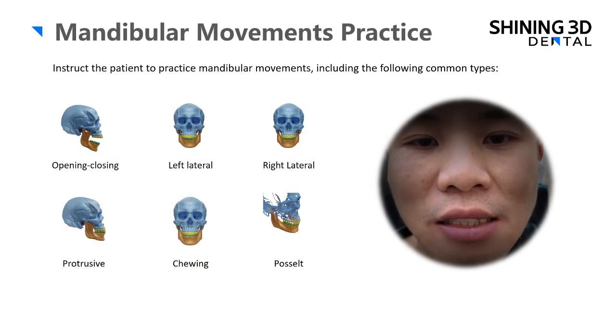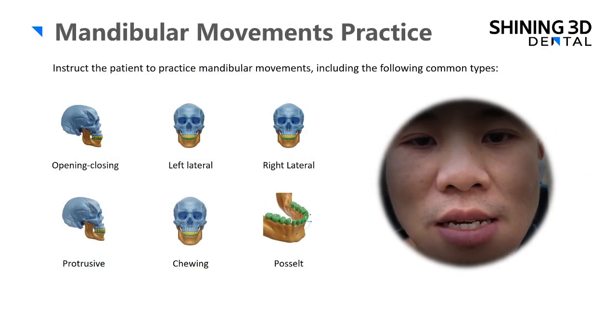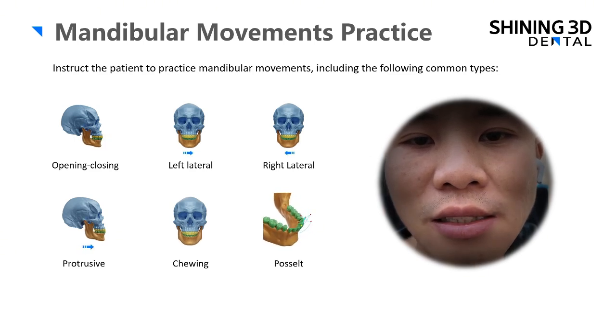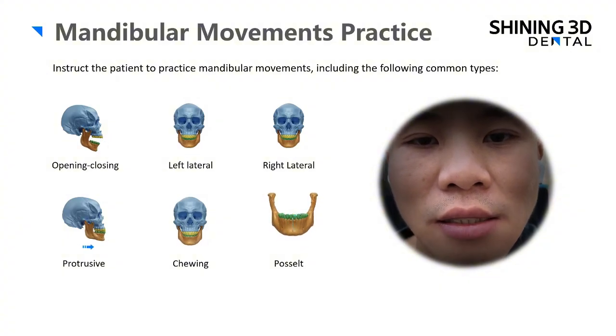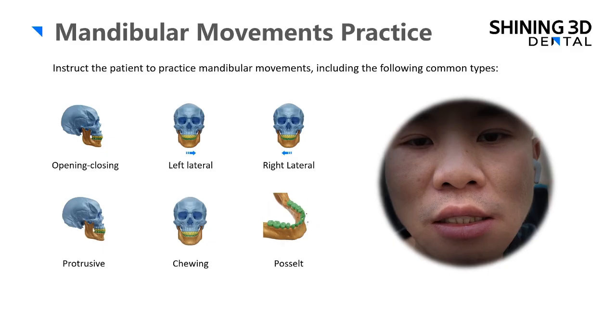There is also another thing we need to pay attention to. After we put the stickers on the patient's teeth surface, it is possible that the patient's saliva will flow to the teeth surface, especially for the mandible. Once that happens, the markers might move, and once they have moved, we have to retake some steps for the whole trajectory tracking or even other function steps.